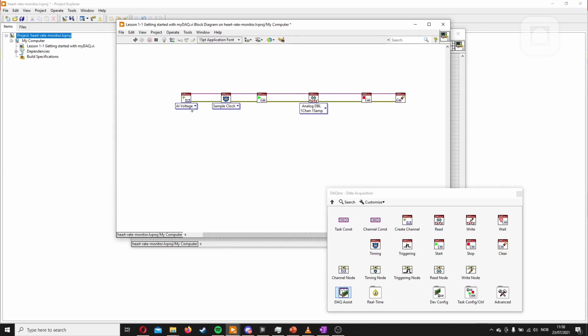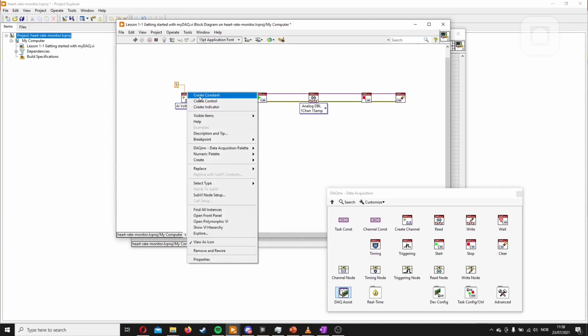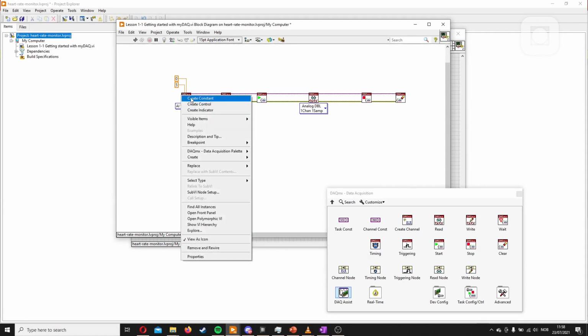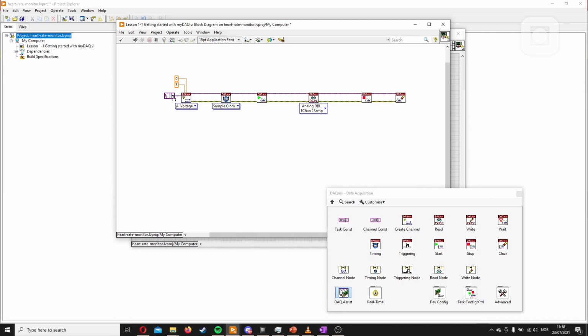We'll start with the resource VI. Here we'll set the maximum and minimum voltage. We have a simple circuit that goes from 0 to 5 volts, so we can just set the lowest as 0 volt and the highest as 5 volt. So you have a task which you can create from the beginning, but we don't care about that. What we do is we want to select the physical channel. So we create a constant and then we choose the MyDAQ. We want an analog in, we want the analog in 0. So we'll select that. And that's it for this one.